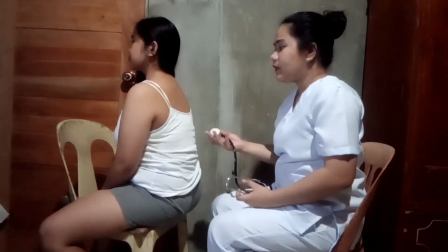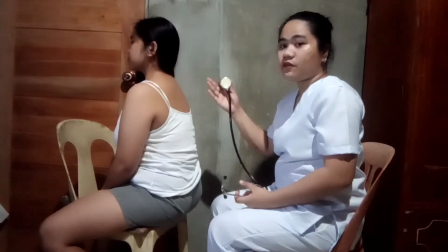Okay, so the sounds of her lungs are normal, so it is fine and there are no abnormalities in her lungs.